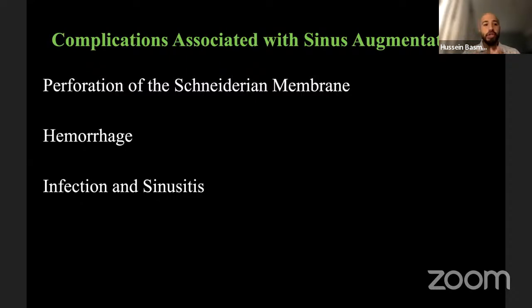That's why understanding the anatomy, and understanding all the 3D x-ray components, the information that the x-ray is offering us, is crucial for successful results. And this is why we always say you have to have a CBCT prior to your bone augmentation or your sinus augmentation. Why? Because if there is any sinus infection prior to bone augmentation, this should be a contraindication for doing what?